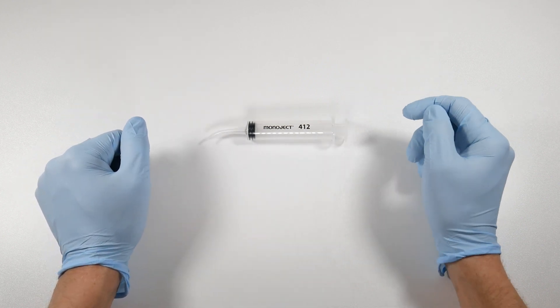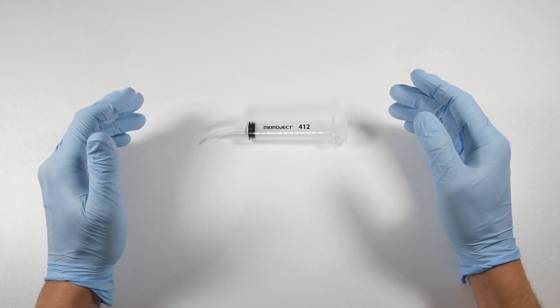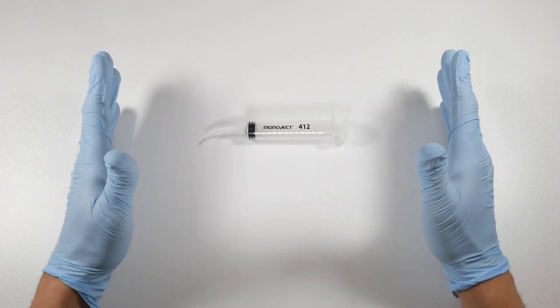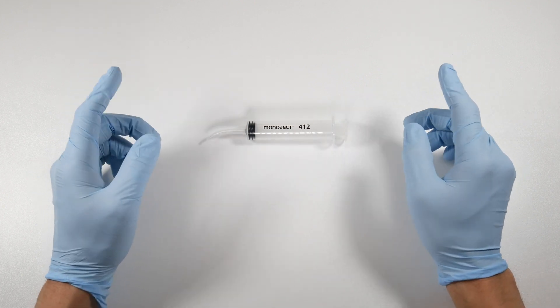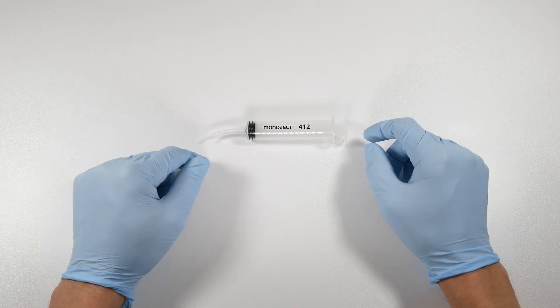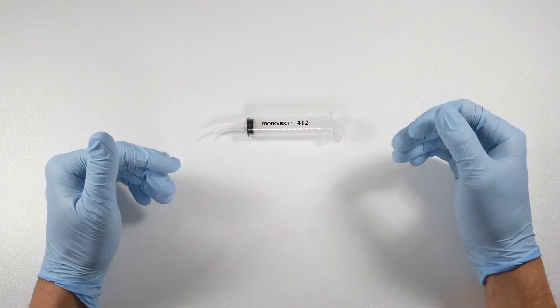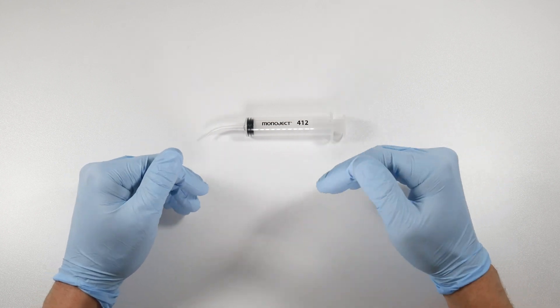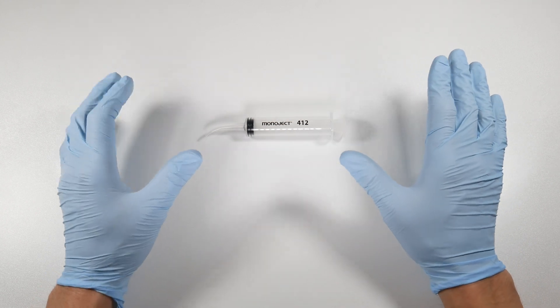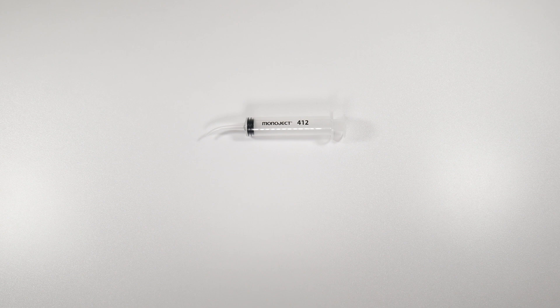That amount of fluid is a copious amount. They always say that the solution to pollution is dilution—that's a saying I've heard many times throughout dentistry. It's just saying that you can spray this in there into the site, clear out as much of that junk as you can to get that flap healing up nicely with minimal complications.